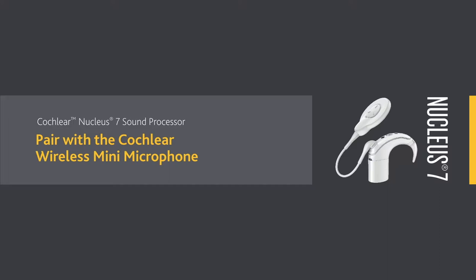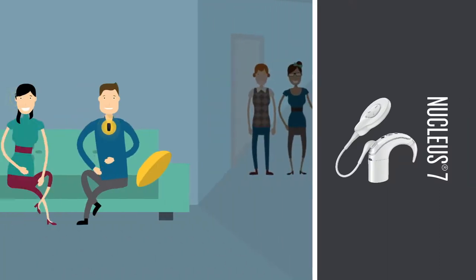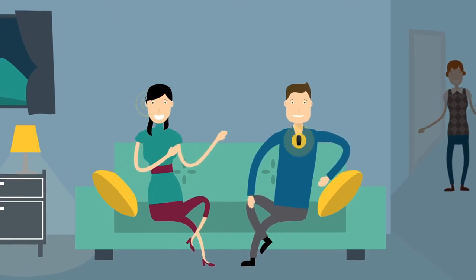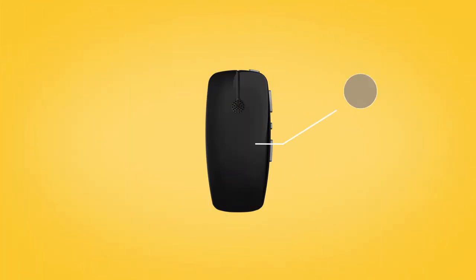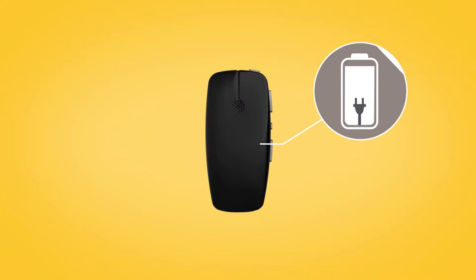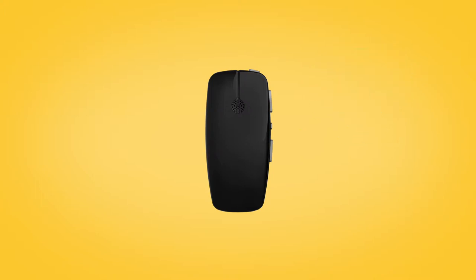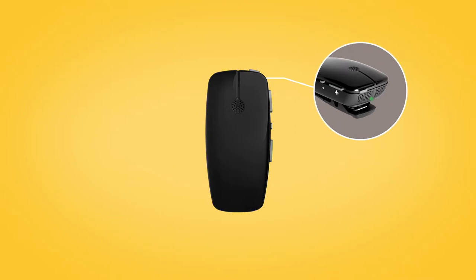A Cochlear wireless mini mic can help you to hear better over a distance and in noisy listening situations. While charging, the LED on top of the mini microphone lights red. When fully charged, it lights green with red flashes every two seconds.